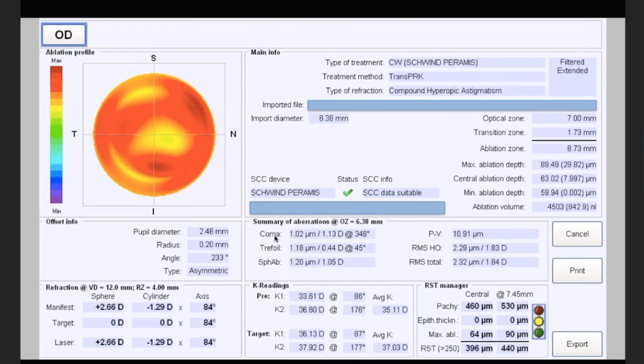And the reason for that is that the topography measurement is not taking account of factors like axial length, factors like the intralenticular astigmatism that are influencing your sphere and your cylinder outcome. And so you have to make a judgment about the refraction numbers you type in. And there are different strategies you can use. If you believe that the corneal astigmatism is dominant, then you can leave the corneal wavefront treatment to drive the astigmatism and simply modulate your sphere based on the refraction spherical equivalent.